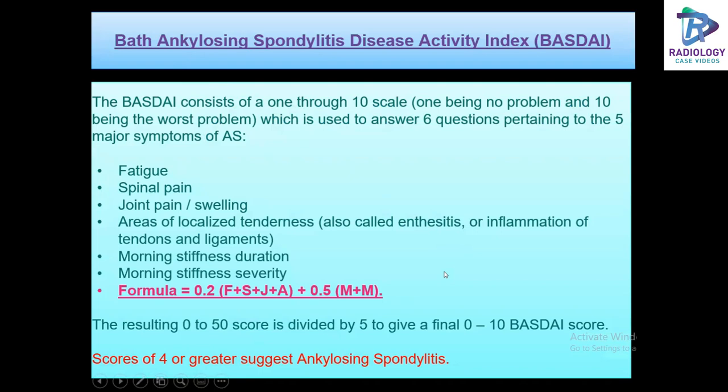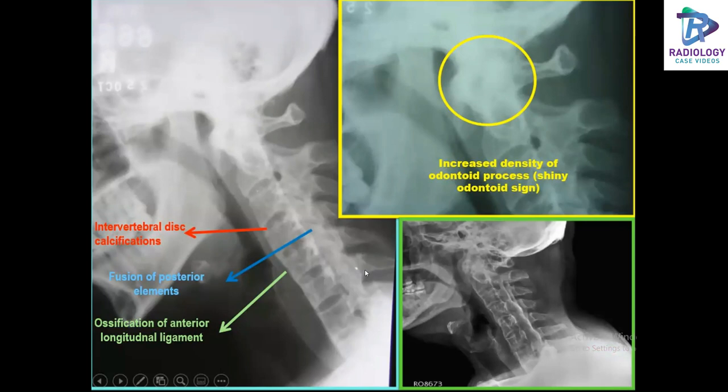Coming to an imaging review — these are lateral radiographs of the cervical spine showing intervertebral disc calcifications, fusion of posterior elements, and ossification of the anterior longitudinal ligament. Here we can see the shiny odontoid sign appearing as an increased density in the region of the odontoid process.